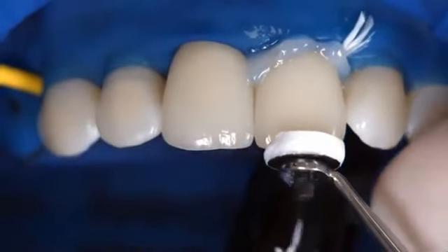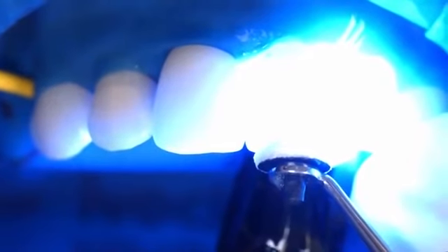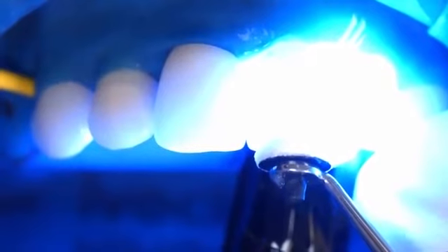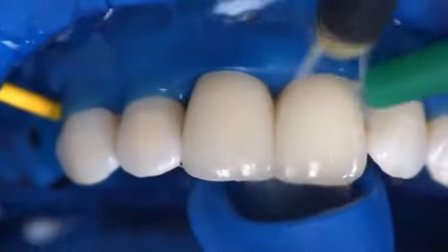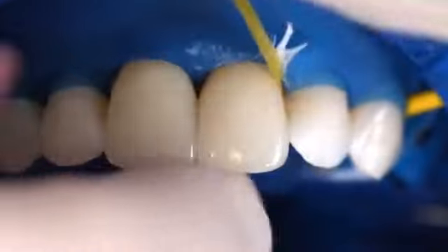Light cure all cement lines again for 10 seconds per segment and per millimeter of ceramic, using, for example, Bluephase Style at a light intensity of 1,100 milliwatts per square centimeter. Rinse off Liquid Strip. Finish the proximal surfaces using finishing and polishing strips.